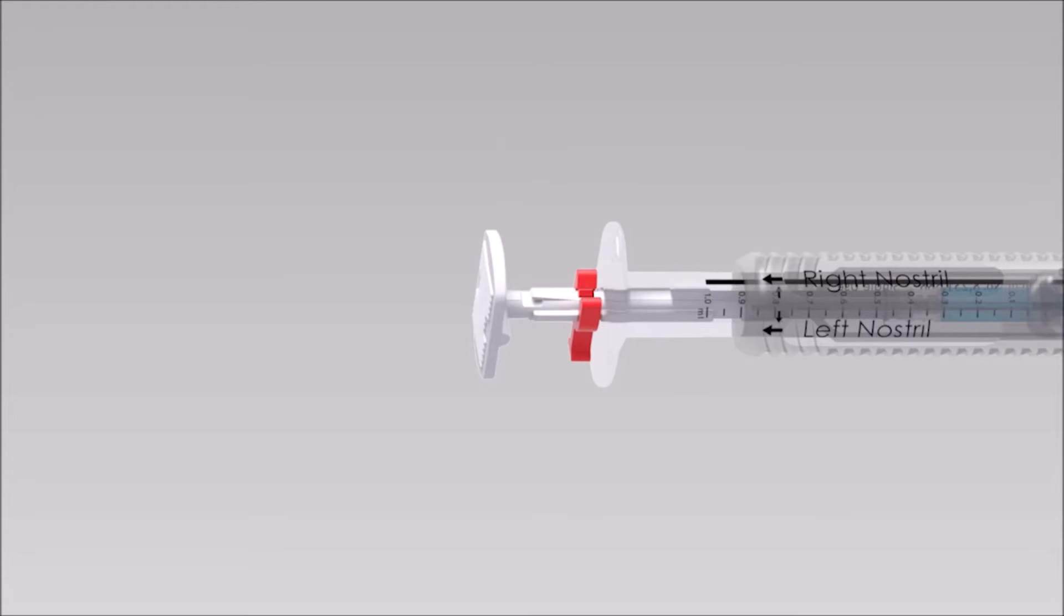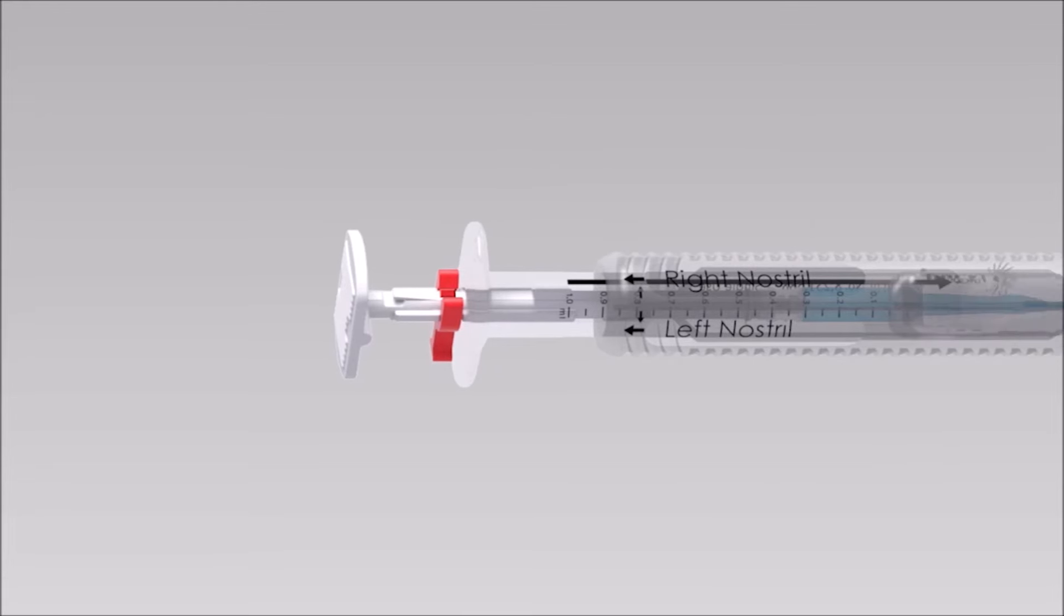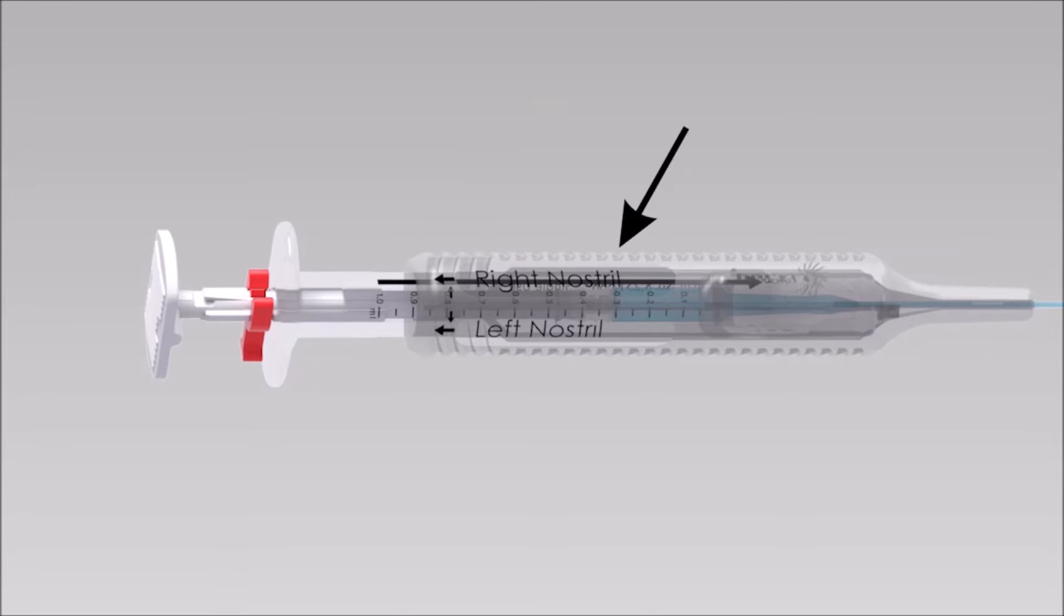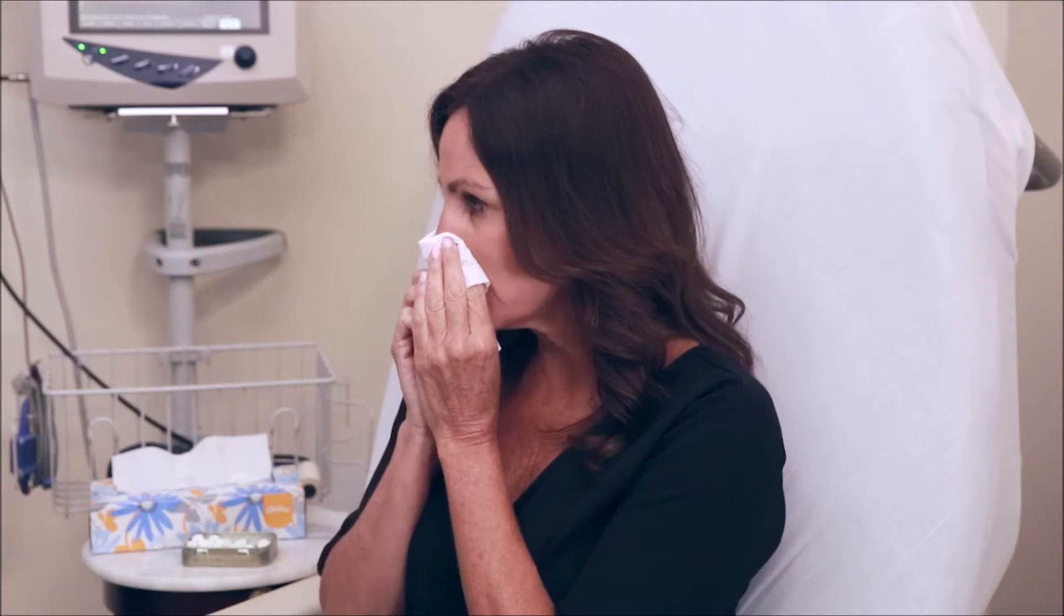The shipping clip stops the deployment at the 0.3 cc point. You have now successfully utilized TX360 on the right nostril. Pull back on the syringe so the soft needle-like tip moves back in place within the device and remove the entire apparatus from the patient with a swift move. Ask the patient to blow and clear the right nostril.